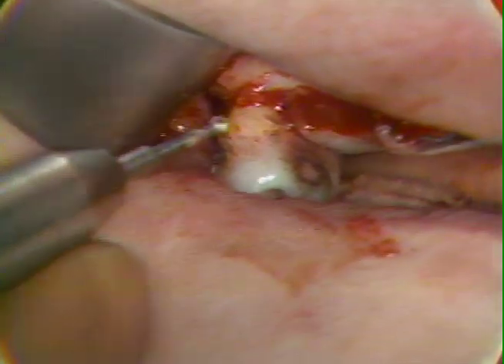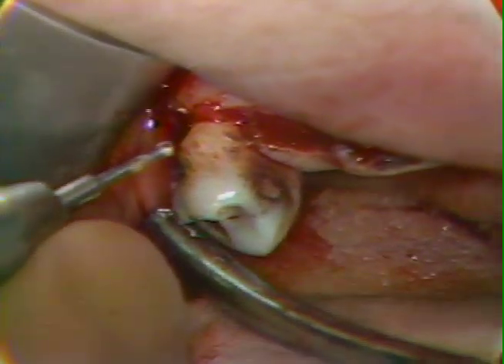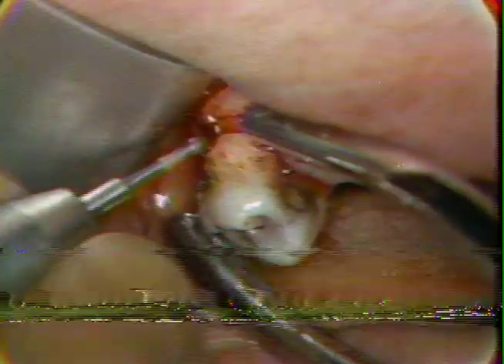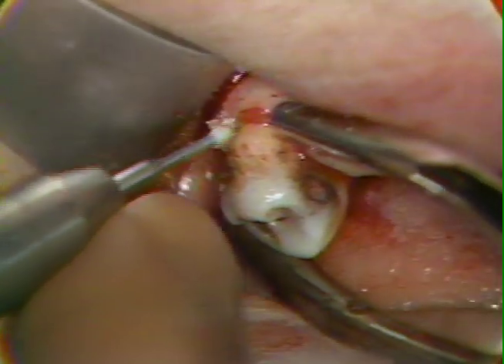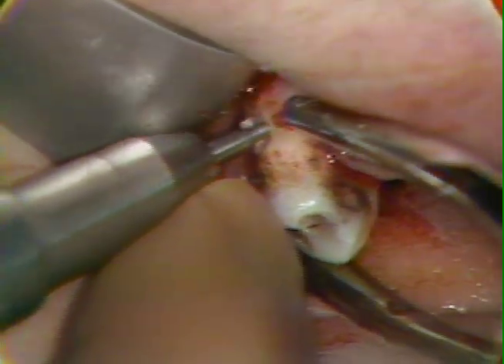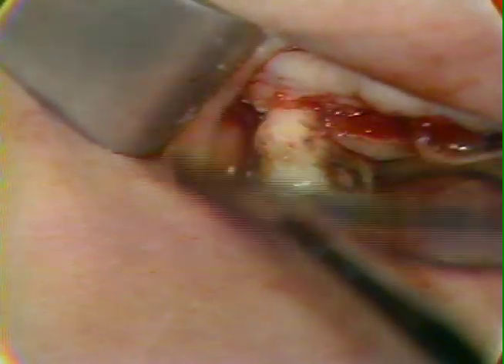If there were a heavy collar of bone up here, we would have to remove that bone to get down to this level. Now there'll be some vibration and noise here. I'm going to go into the bifurcation of the two buccal roots, and I'm penetrating that bifurcation. I'll follow that penetration with a cross-cut fissure burr.